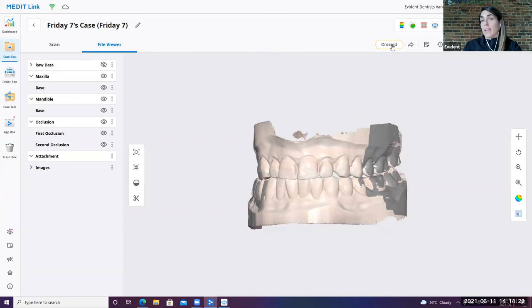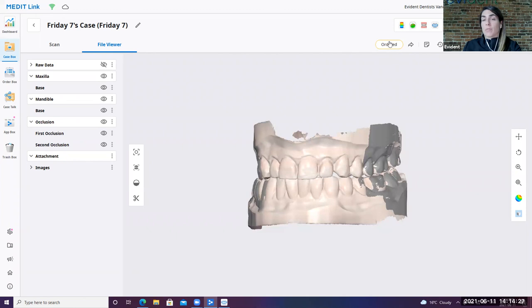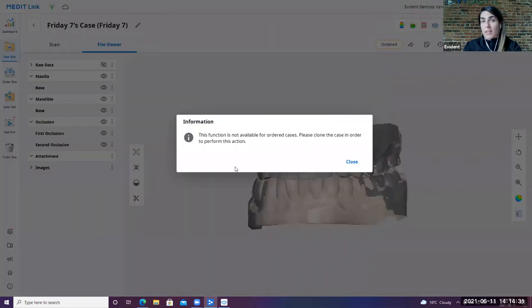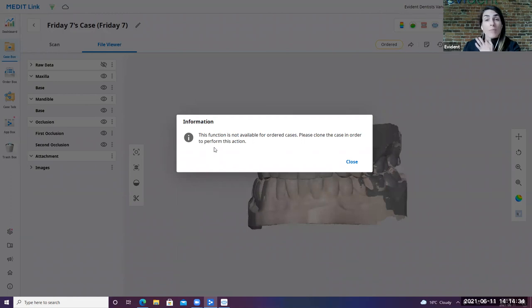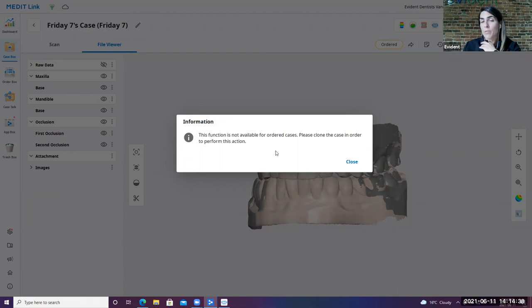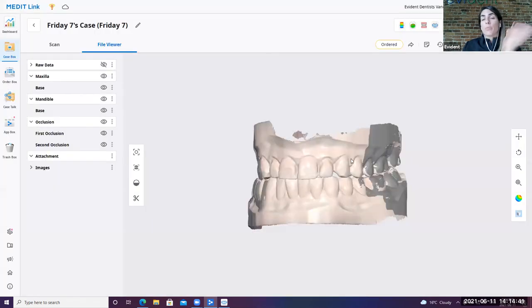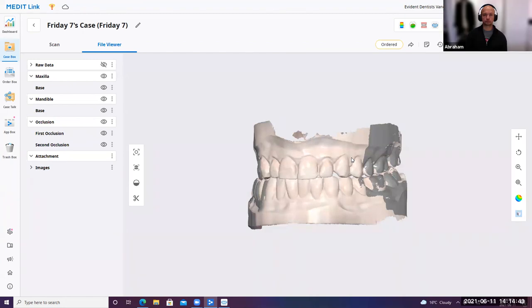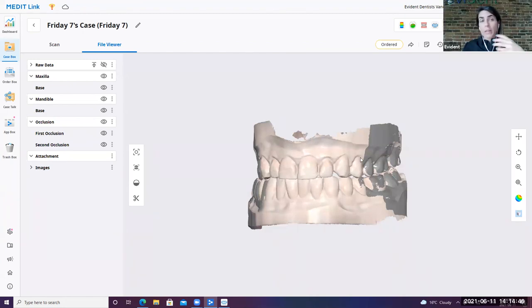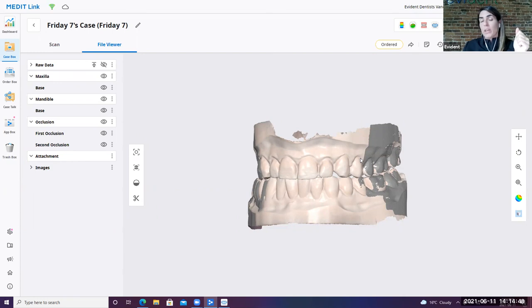And you can see now that the case has been ordered. So I'd mentioned earlier in our demo, if you've already sent a case that is not able to be modified. So if I were to go ahead and try to open this case, I do have a notation that comes up that indicates to clone the case in order to perform the action because you're not able to adjust any of that stuff. So again, in our training, we go through situations as to why you need to clone, what things might come up and everything else in between to ensure that you're as successful as possible.